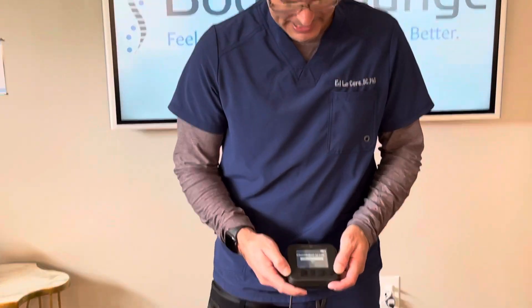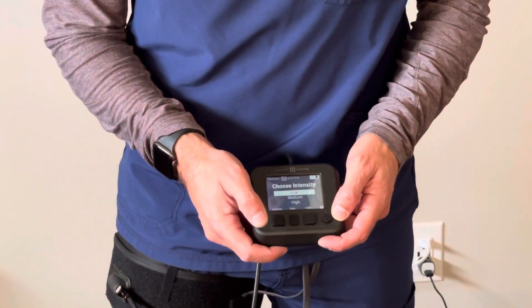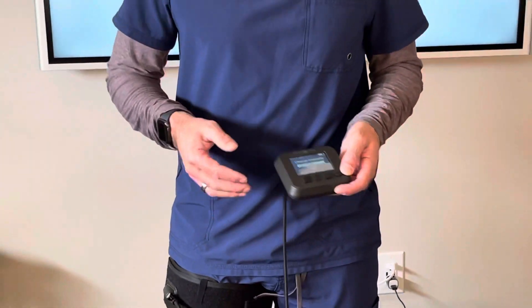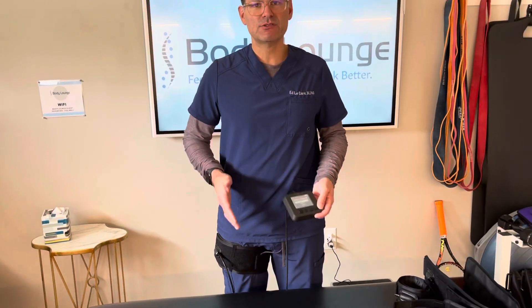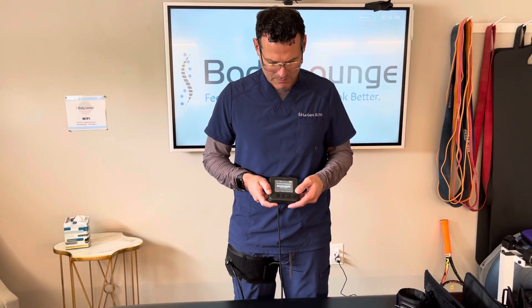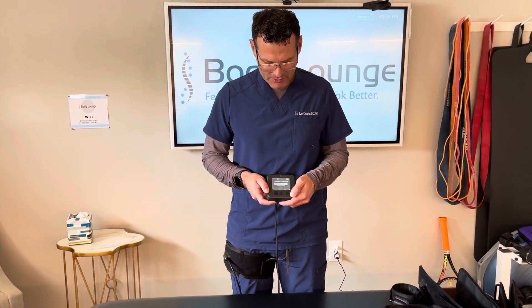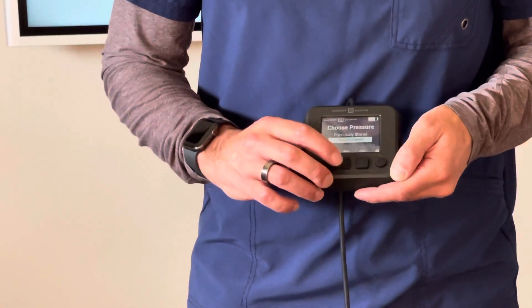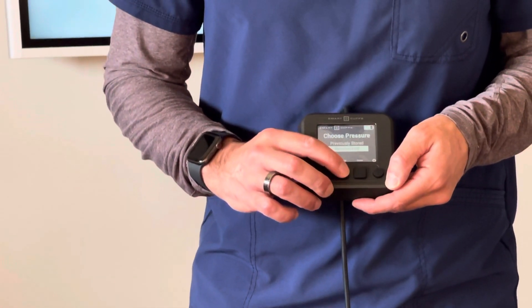I'm going to start exercise, select leg, and go to low pressure, putting even pressure through my feet so that my muscles are both contracting at the same rate. I'm going to hit enter, and I'm going to do recalculate because the previous one I did was for my arm. So I'm going to recalculate it.